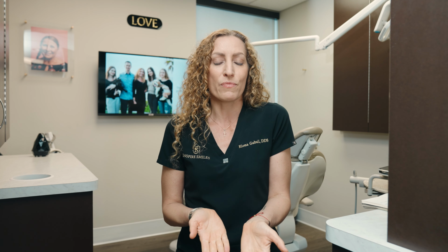If we place this implant in the bone and it fully integrates and then build a crown on top of that, the tooth is actually now stronger than before. It would be really, really critical, right, to put it in the right place. Otherwise, we really can't do too much about it. We can't move it, so an implant does not move like any other tooth, and we can't fix it later because it literally becomes part of the bone.